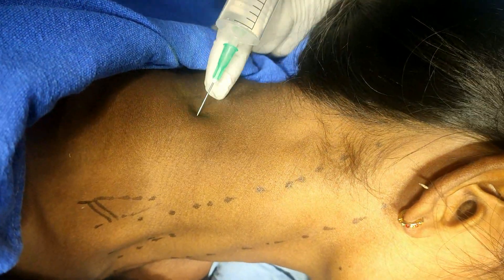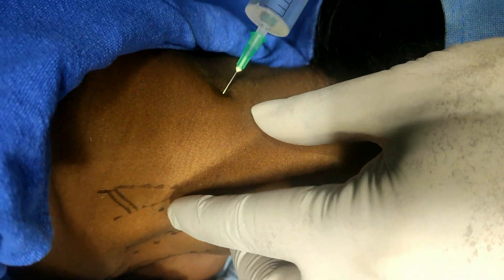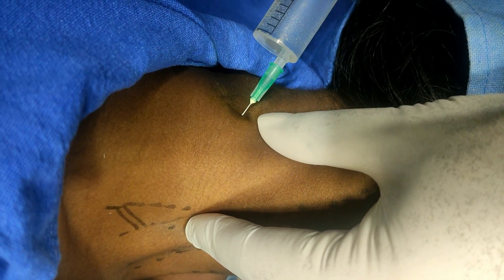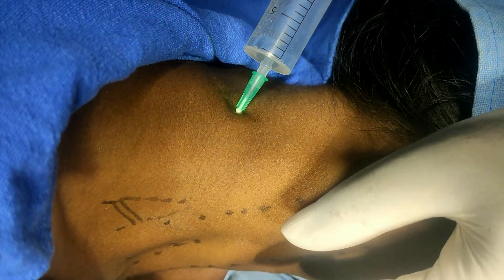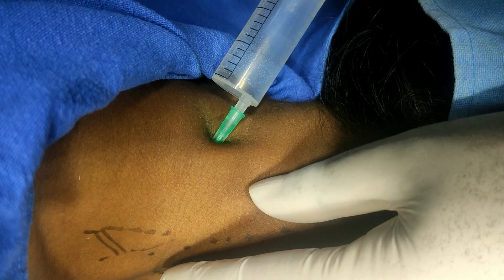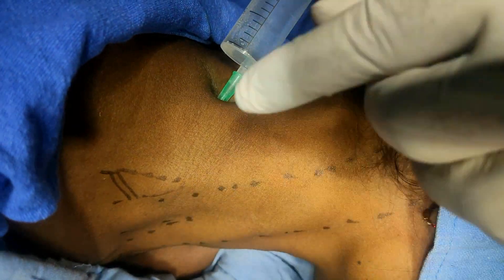This is the entry point of the needle. After a skin wheel, insert the needle from here and move deep to the levator scapulae, moving towards the interscalene triangle. Start injecting fluid after aspiration — aspirate then inject — and move towards this triangle. There should not be any resistance.